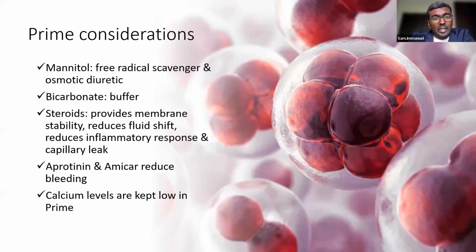Added to it, mannitol as a scavenger and also osmotic diuretics. Again, there is a very big debate going on whether mannitol can be added in prime or not. And the debate is still very long. It is not concluded. There are many centers which has totally taken off mannitol in the prime as well, but having a very good results.